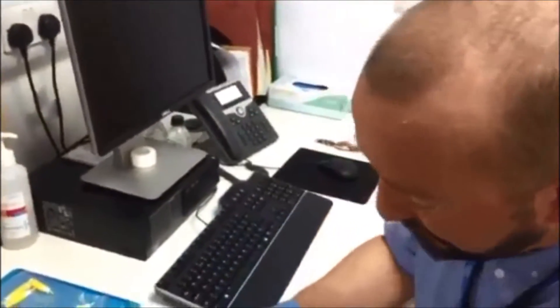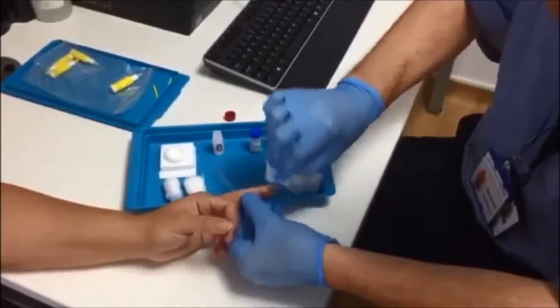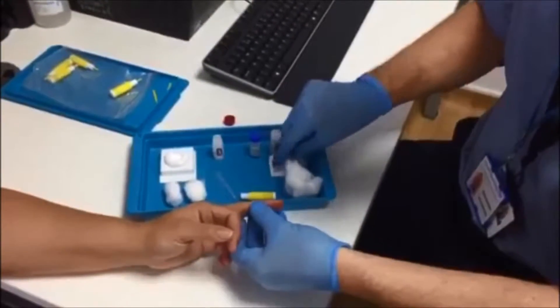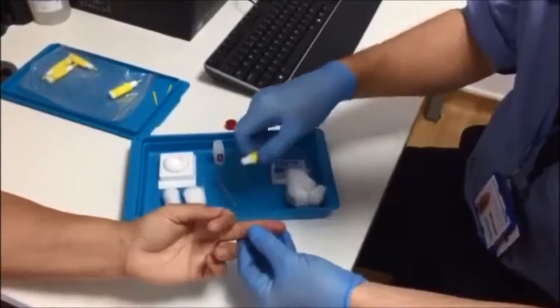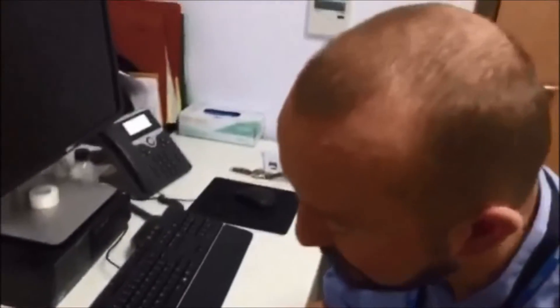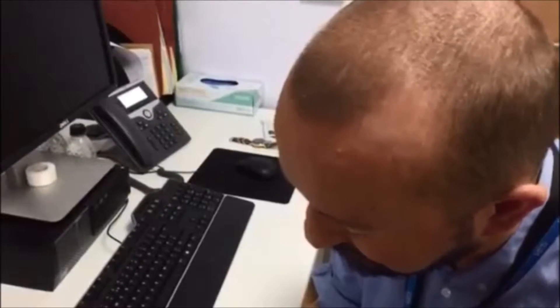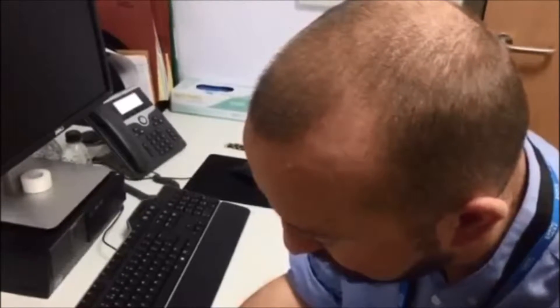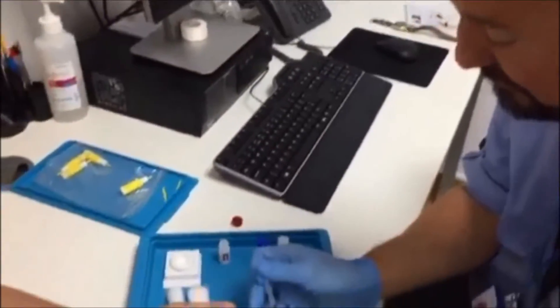What we need to start with is a finger. We just need to swab that with an alcohol wipe right there to make sure it's nice and clean. Then we just do a sharp scratch on your finger and put it onto the testing platform. There we are — are you feeling okay? Yeah, fine.